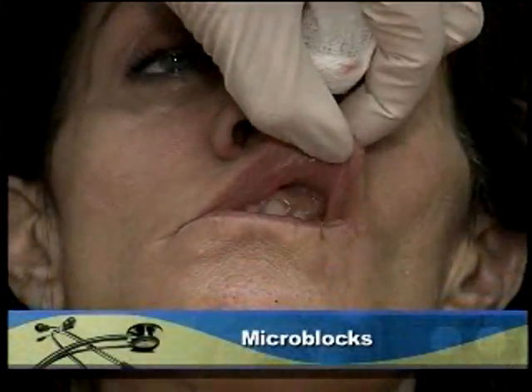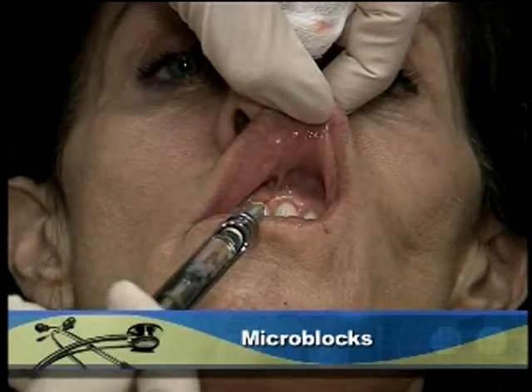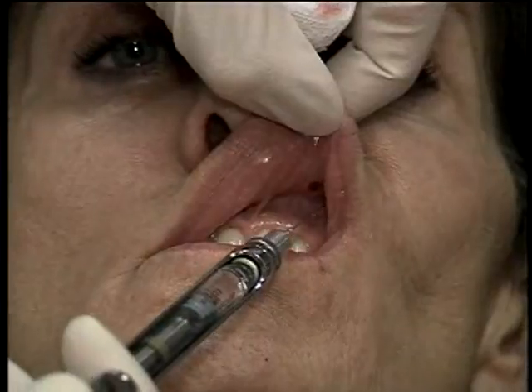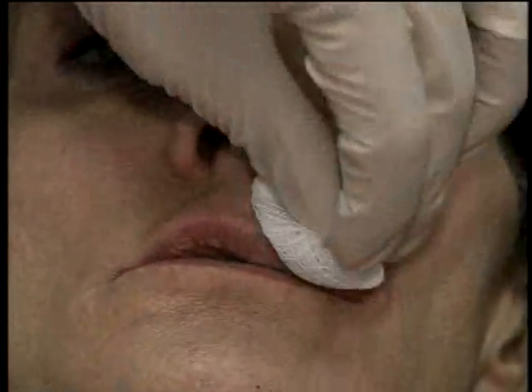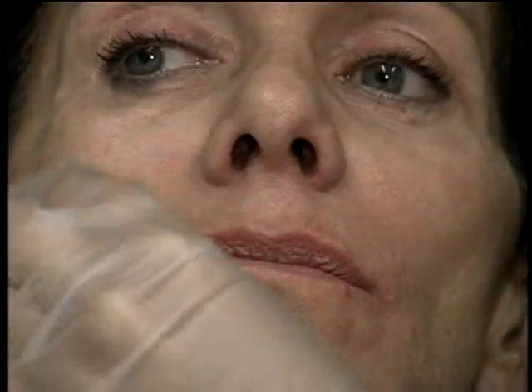Now, some people will do micro blocks, where you just place little injection aliquots along the gingival buccal sulcus, like such. This is another way of doing it. I don't use that method. The advantage to that method is that you have much less of a nerve block, and sometimes patients can feel a little bit uncomfortable with this nerve block. So for those who are uncomfortable, you can do those micro injections, but I tend to prefer to use a complete nerve block.